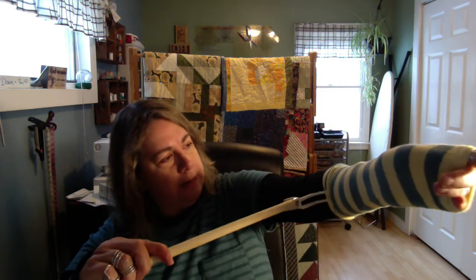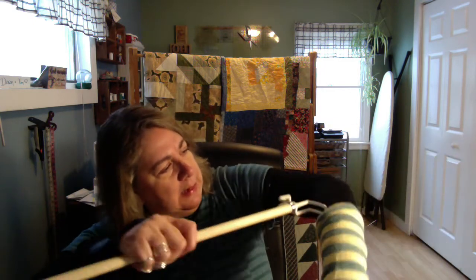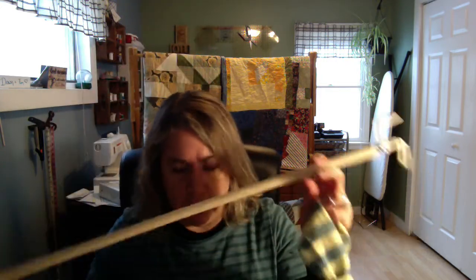What you do is you take this little tool, and you see this piece right here? So you would slide it on the top of the sock, inside, like this, and push down. And oh, look at that. The sock comes off. Isn't that great? It's also great if you are, say, trying to put on your underwear and it falls on the floor. You can kind of scoop it up with this little hook. And then I just use this end, and I have these tools hanging on the side of one of my dressers. So another great little tool.